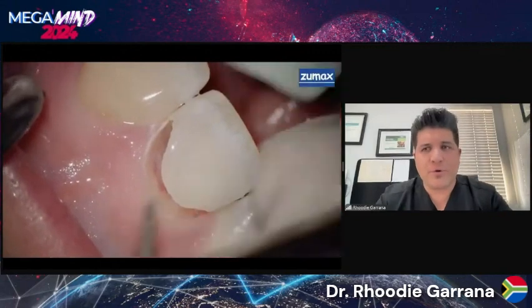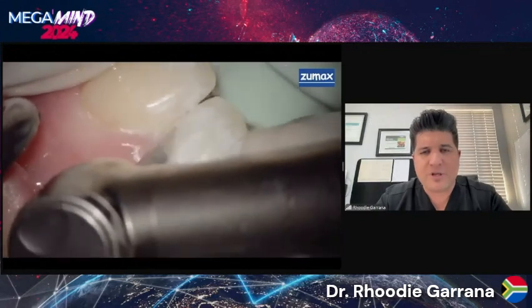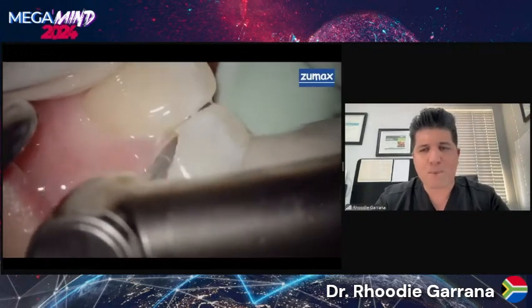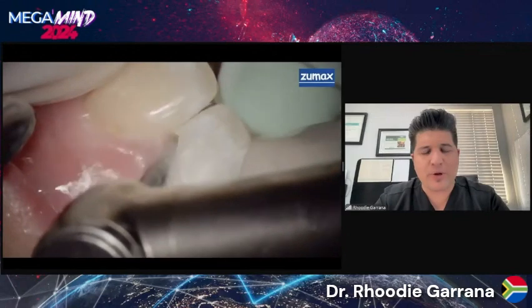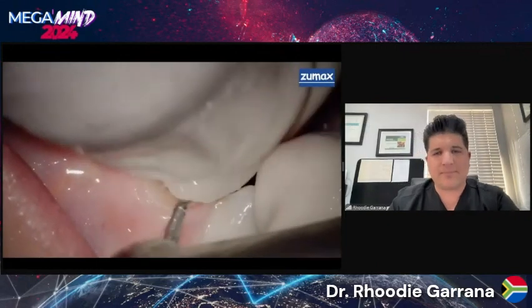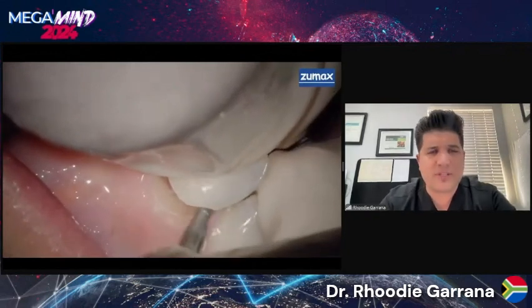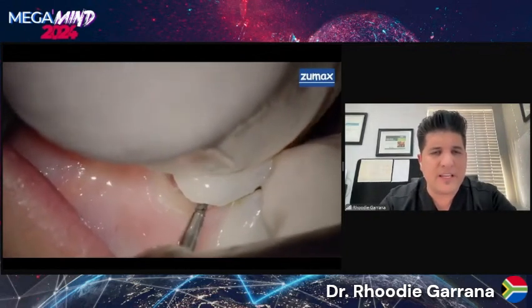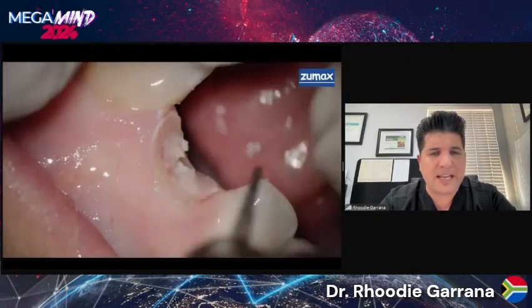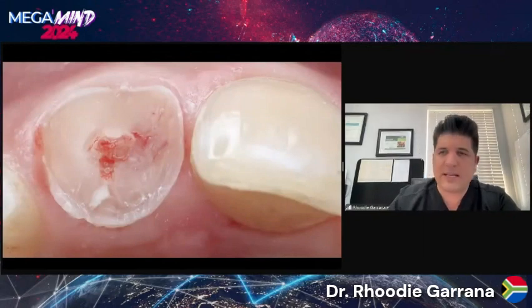So I decided to remove the crown using a very, very thin fissure burr supplied in my socket shield armamentarium, making sure that we are not damaging the soft tissue, applying slight lateral force on the crown. And so I can remove the crown at the level of the gingiva so I can get a good look at what's happening. And we can see clear signs of the resorptive tissue and the granulation tissue inside the canal. Not a lot of sound tooth structure left on the inside of that tooth.